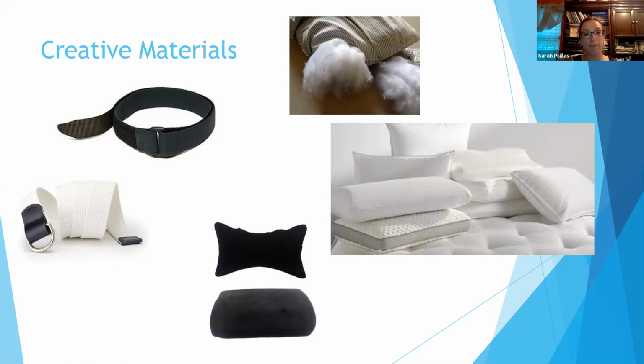You just want to remember with some of these materials that because they're not specifically designed for wheelchairs or positioning, you need to make sure you pay attention to the client's skin integrity. These obviously can dig into someone, and if they have swelling or they're older and have really thin skin, you want to make sure you're paying attention to that.